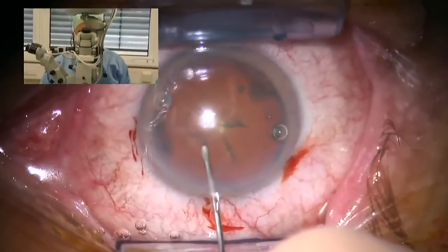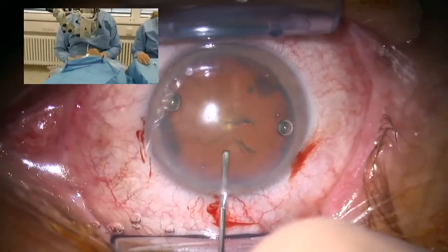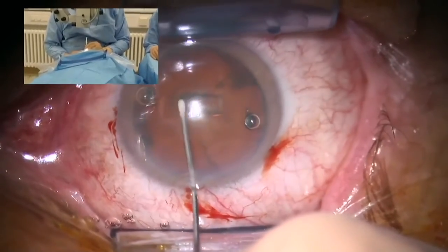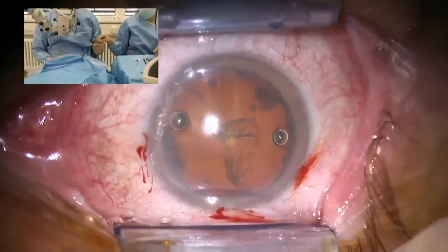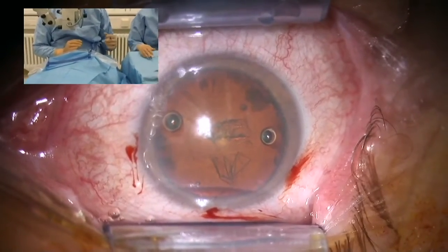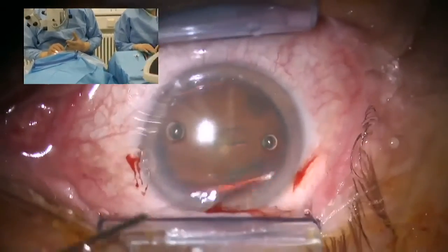And your nanolaser settings? The nanolaser setting is 6.5 microjoules per pulse. And firing rate? The firing rate is up to, let's say, 8 hertz in this setting, because the triggering of the laser pulses is via the vitrectomy port.